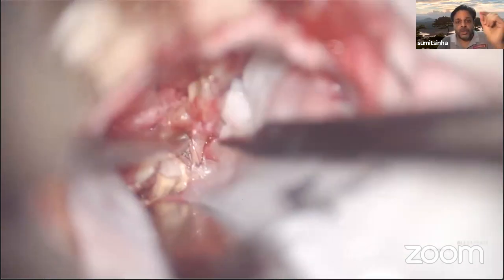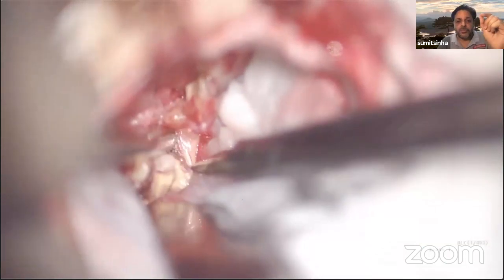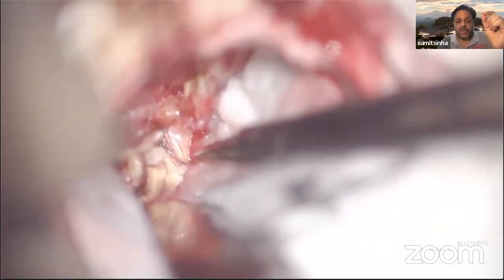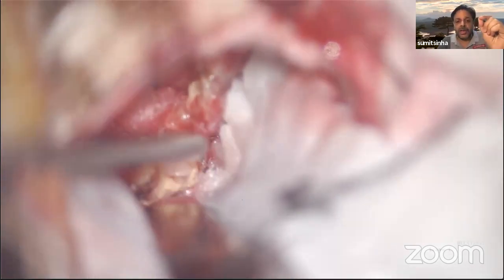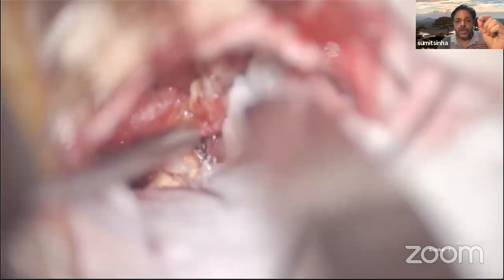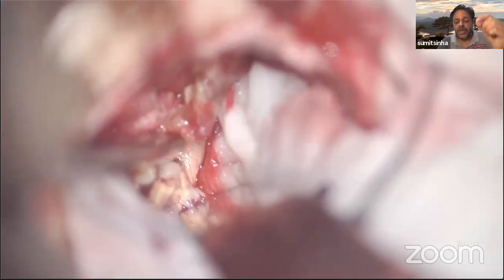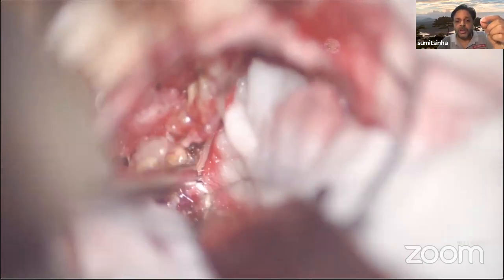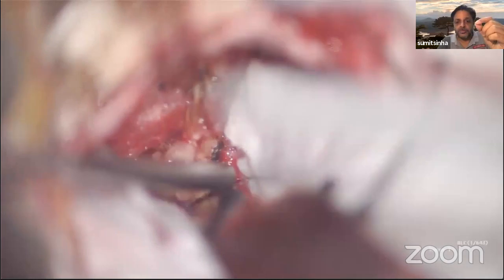Important vascular structures run on the surface of the brainstem in this area, especially the mesencephalic vein. You have to be very, very cautious of preserving this vein, and this is a very important drainage area for the brainstem. So when you encounter this vein, you have to be very careful in separating the tumor capsule from this vein and take every good care that this vein gets preserved in its entirety.